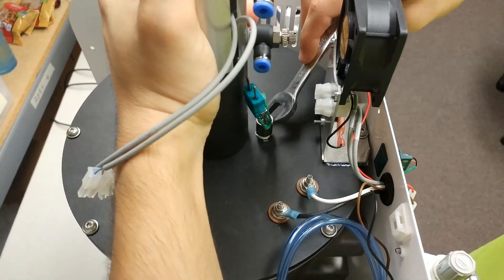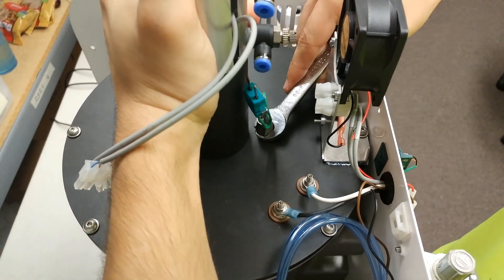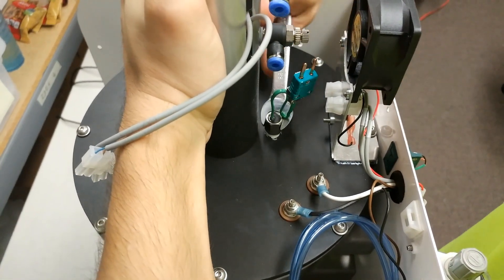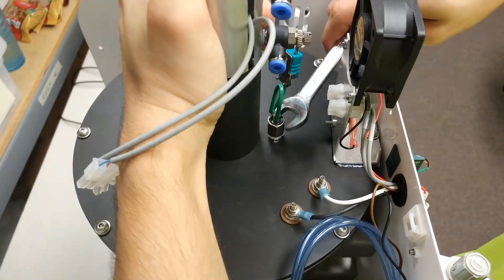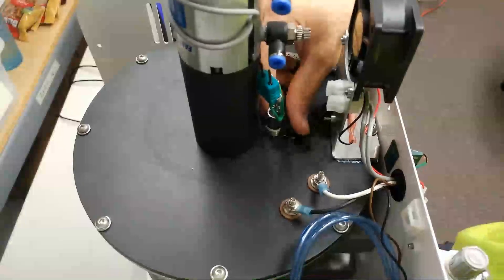The next step is to go ahead and untighten your thermocouple. Grab that 13 millimeter or half inch wrench and untighten it. You may need to use a little force, so you can either grab the pressing cylinder if you have a pressing furnace, or grab the side of your chamber for more stability. If you're grabbing the side of the chamber, please be careful if you have a silver plate as your muffle plate — it is sharp and it can cut you.